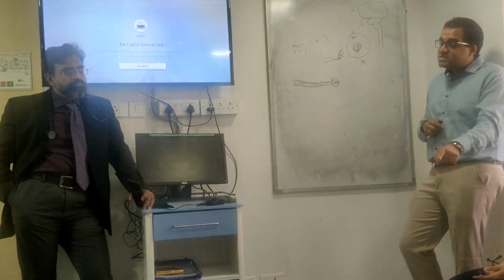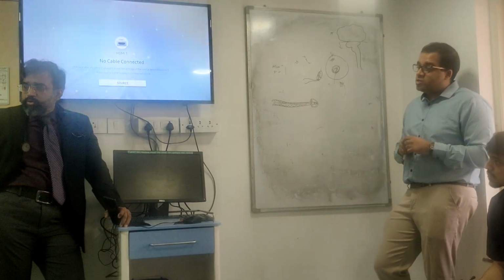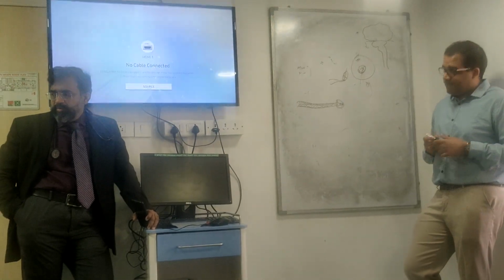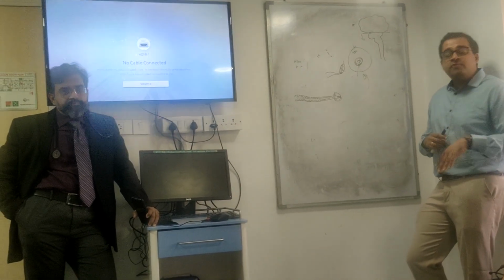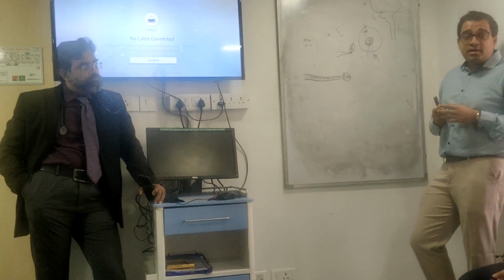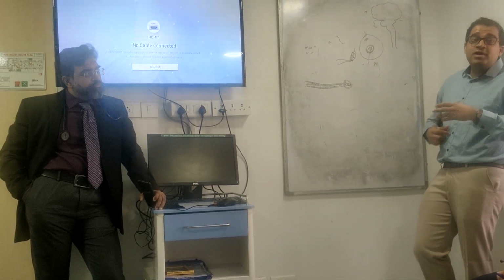But if on day 5 you're still stuck for a diagnosis, the culture has not grown anything, the patient is not improving, then at that time we'll call them and tell them, please keep it for an extended duration because we need to figure out what's happening. They will check with the same bottle. मतलब reculture नहीं, same bottle continue longer करेंगे. And many times you've gotten the answer at day 8, day 9. कितने सारे vertebral osteomyelitis हो गए pre-treated antibiotics have kept cultures for 15 days. I would get Pseudomonas on day 12 and all.